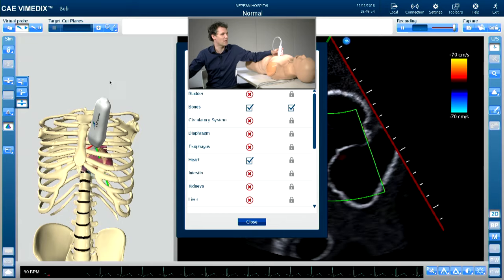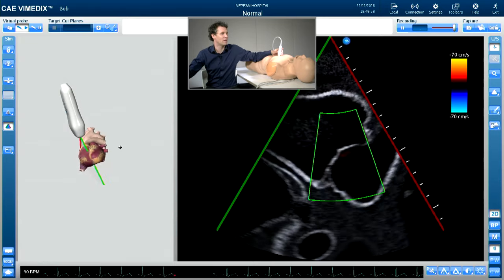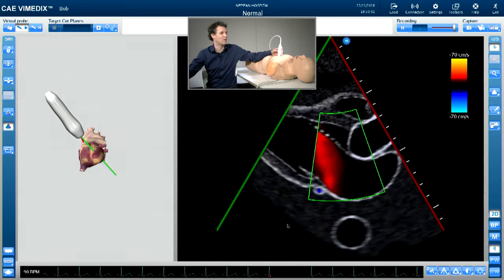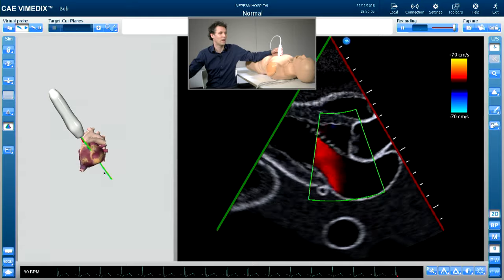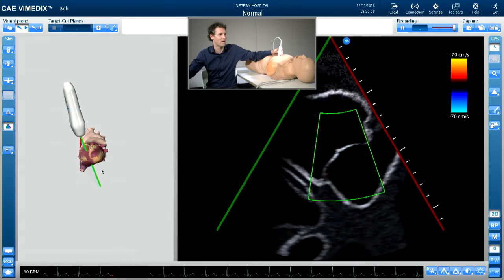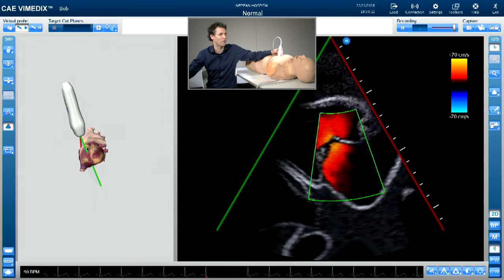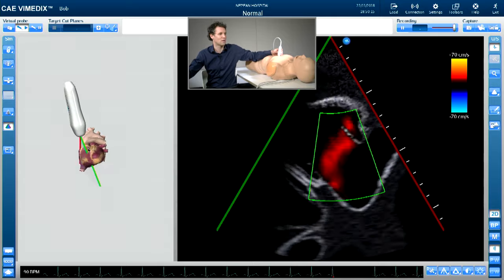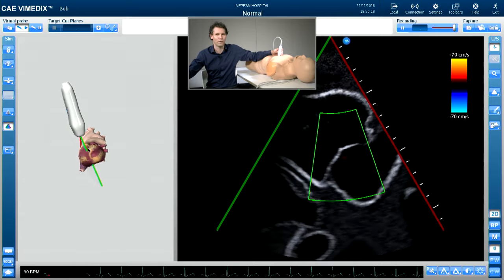I'm just going to take off the bone so that you can see the angle that's changed from the parasternal long axis view. As we fanned down, we're pointing more towards the right hip now, and now we're looking through the right ventricle, the RV inflow view. That's the difference from the parasternal long axis view down to the tricuspid view, or the RV inflow view.